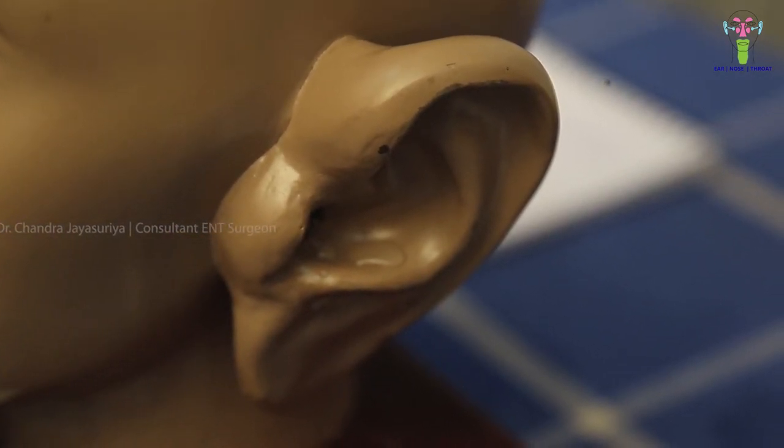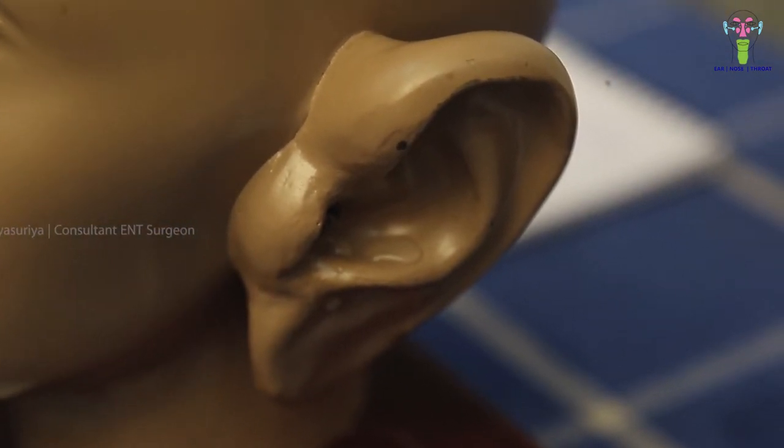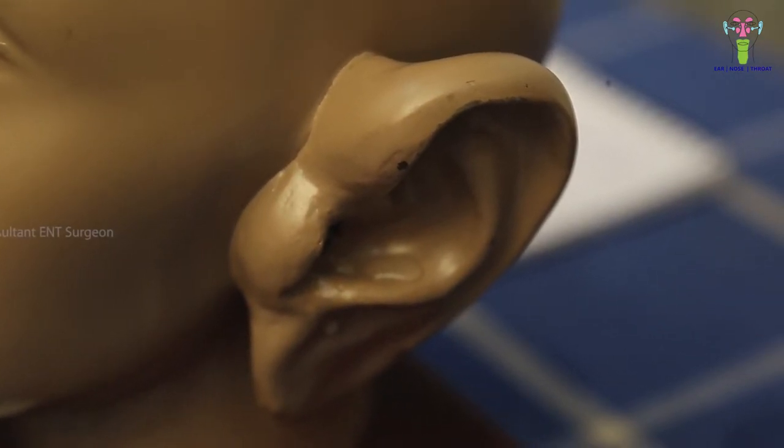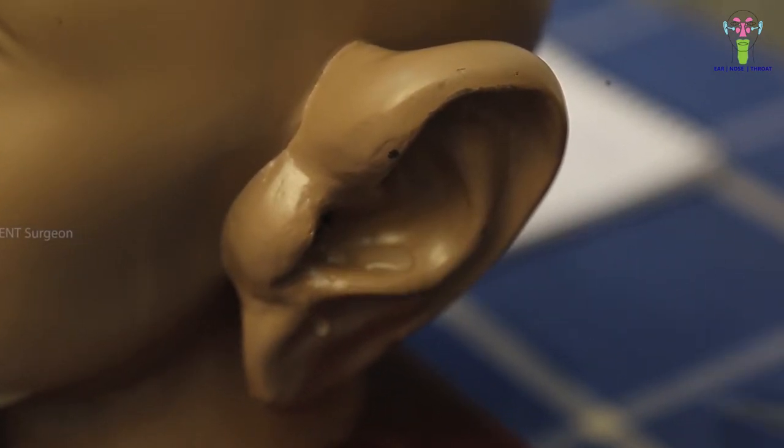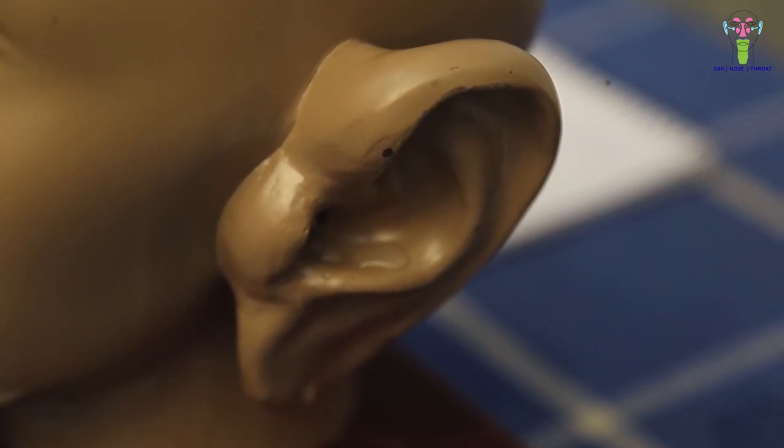This gives relief when there is ear canal edema which doesn't allow us to pack the ear canal with the ribbon gauze. Because it's so small we can insert it, but patient cannot remove this wick on their own. They need medical help and have to come back to the clinic.